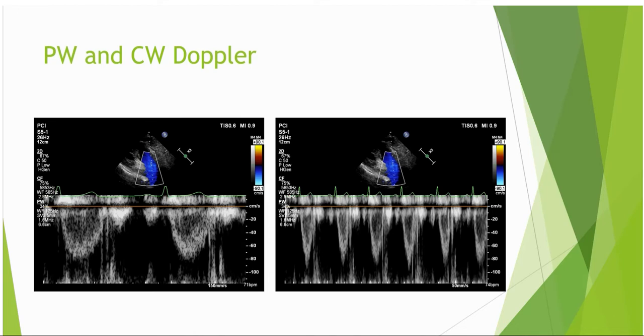Increase the sweep speed too high and it's impossible to determine a peak, as we can see in our first image, particularly the first profile. Also, as the lines are further spread apart at a high sweep speed, it may be difficult to determine the modal velocity, the inner bright part of the trace that is desirable to trace in most modalities. Decrease it too far, and it's very difficult to obtain a VTI tracing when drawing with a trackball. Again, it's easy to introduce error to the measurement attained.